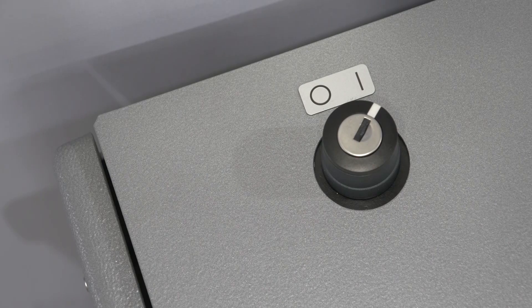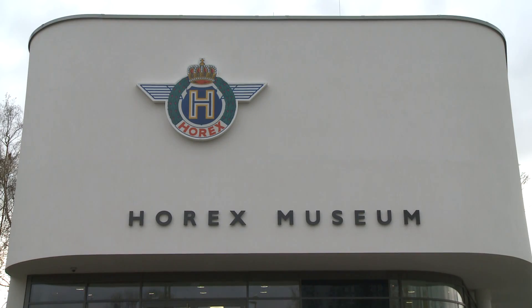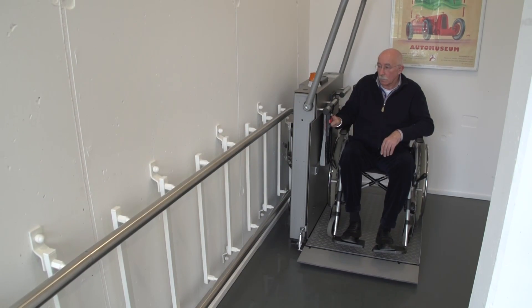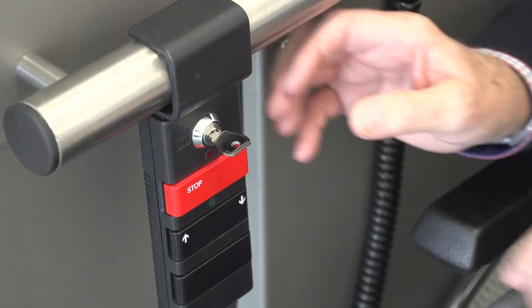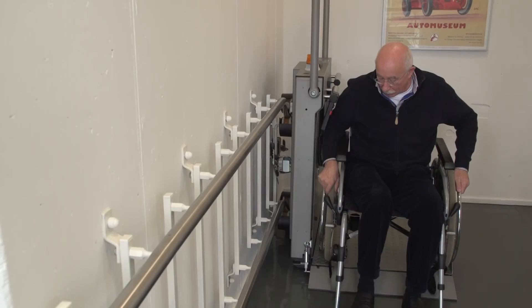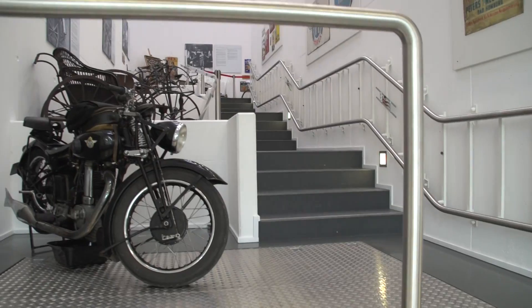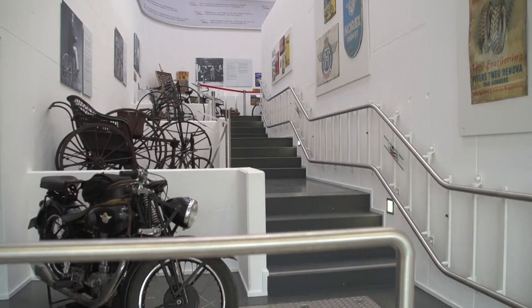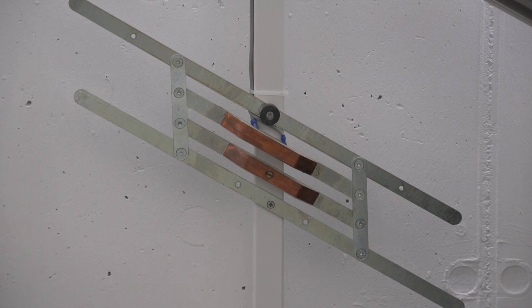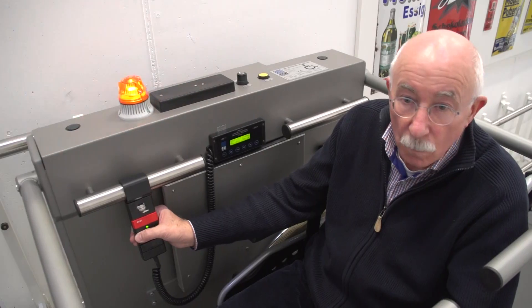To keep the system on standby, simply leave the key switch in the on position. For lifts in areas with public access, the key on the platform should be removed after use to prevent unauthorized use. Many lifts connecting multiple floors have one or more intermediate stops where the lift automatically stops for two seconds.